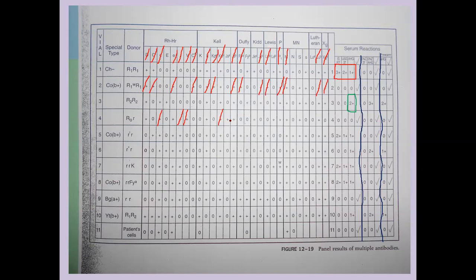So remember, when we have these low frequency Kell antigens, I'm going to say go ahead and eliminate them when they're there because you're never going to find it homozygous. Okay, we can get rid of Jk a. Le b. Nothing for N. We can get rid of big S. Okay, and that looks like about it.